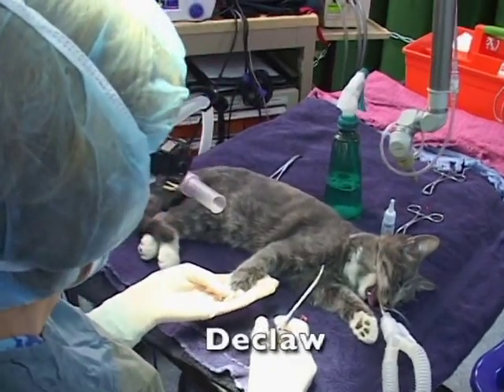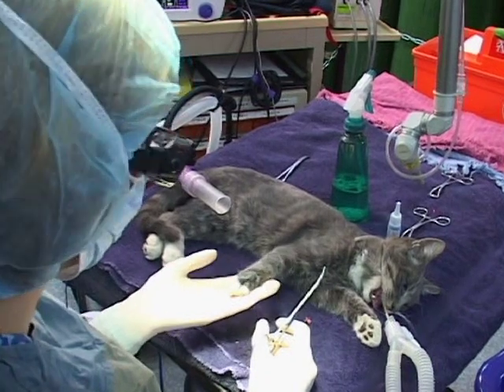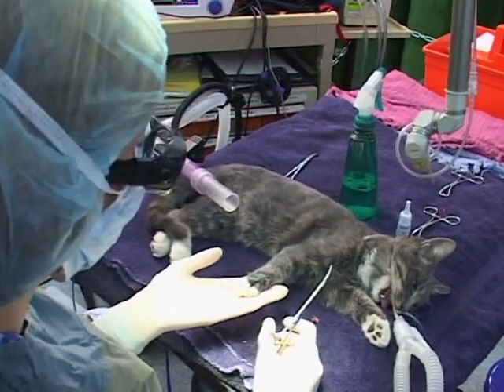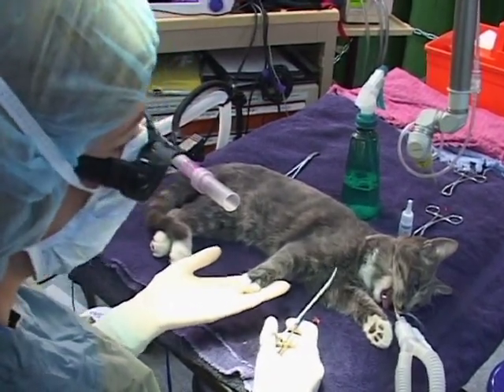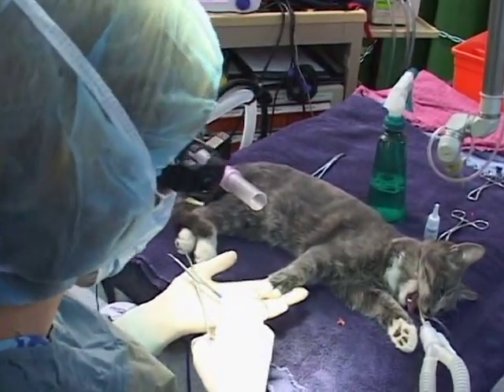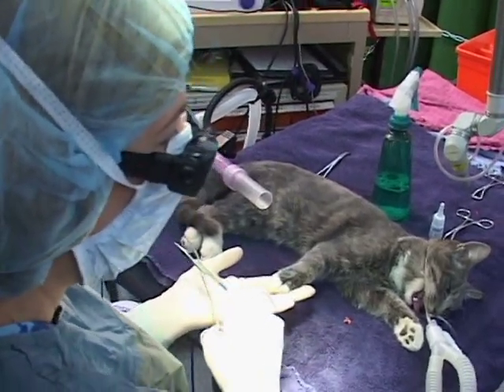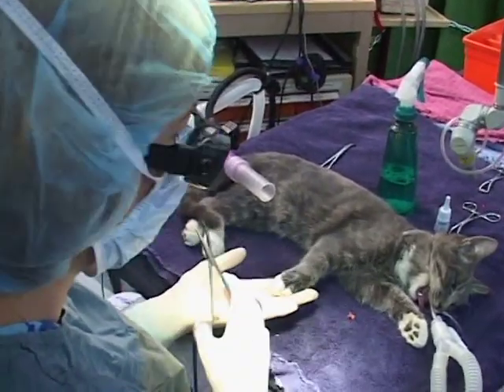We're doing a D-claw on this cat, and one thing that a surgical laser allows us is to do this now with a more ethical standpoint, as well as less pain. We're going to have less pain, less swelling, we're going to seal nerve endings as well as blood vessels. And with a scalpel, those things aren't possible.